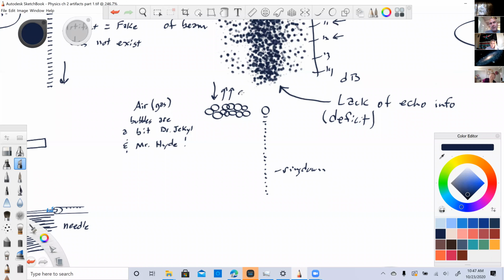Let's say 95% reflection. Well, if you have 95% reflection and an air boundary, you basically have nothing left. Because also, when you think about it, the echoes coming back from whatever is behind the air too are going to reflect back. So even if the echoes are created, now they have to go through that air barrier as well. So air creates shadowing as well, although it's a messy shadow.